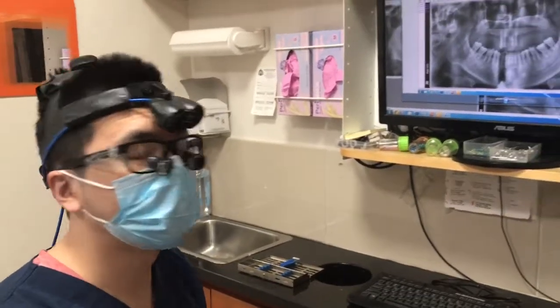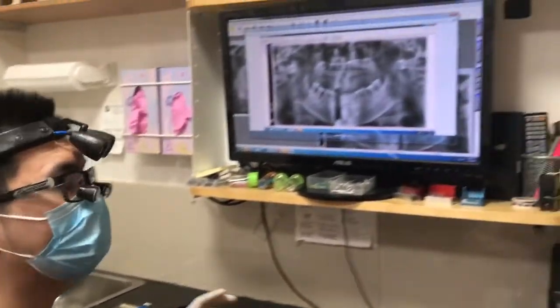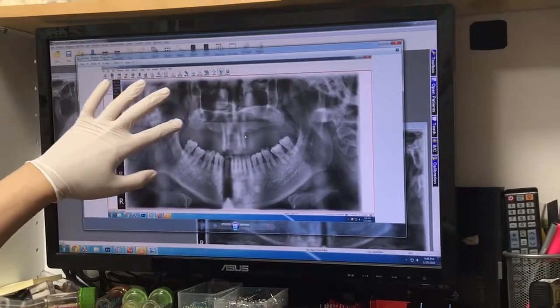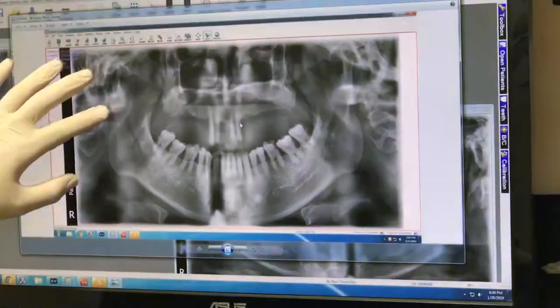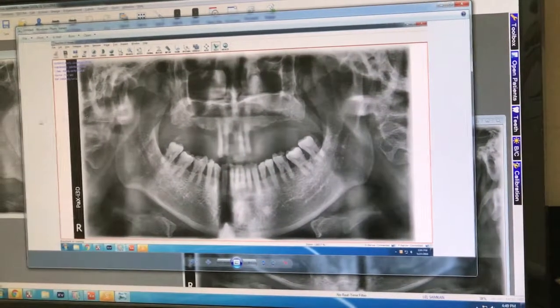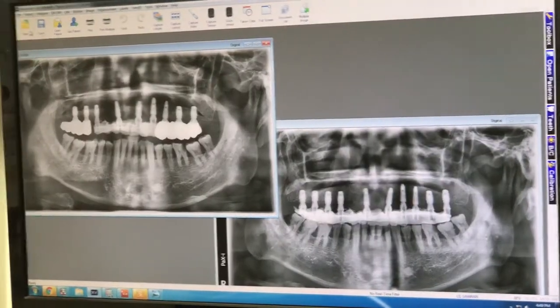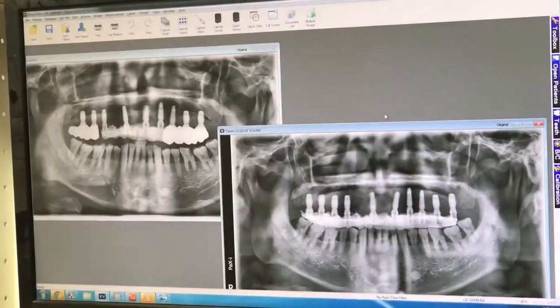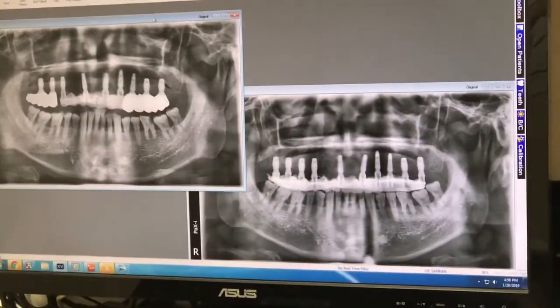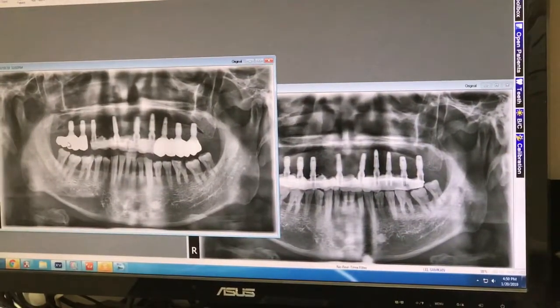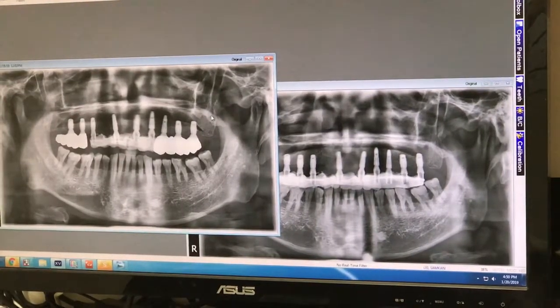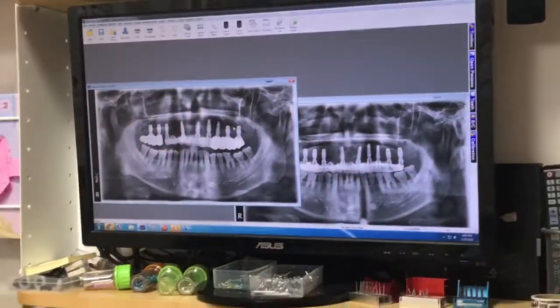Hi guys, today we're starting an upper full arch implant. A patient came in with very few teeth on the top — they were periodontally diseased and mobile. We were able to extract all of them and give them fixed temporary teeth. We restored the posterior last time, and now today we're starting the anterior.